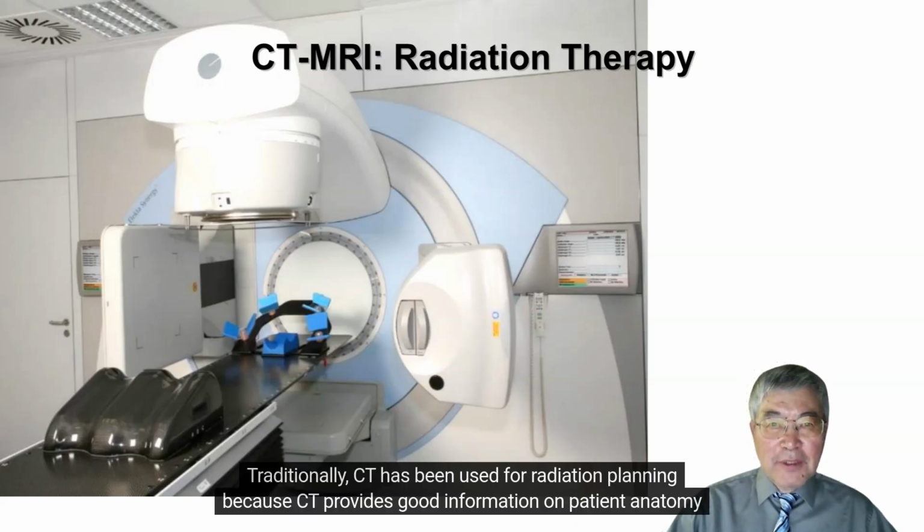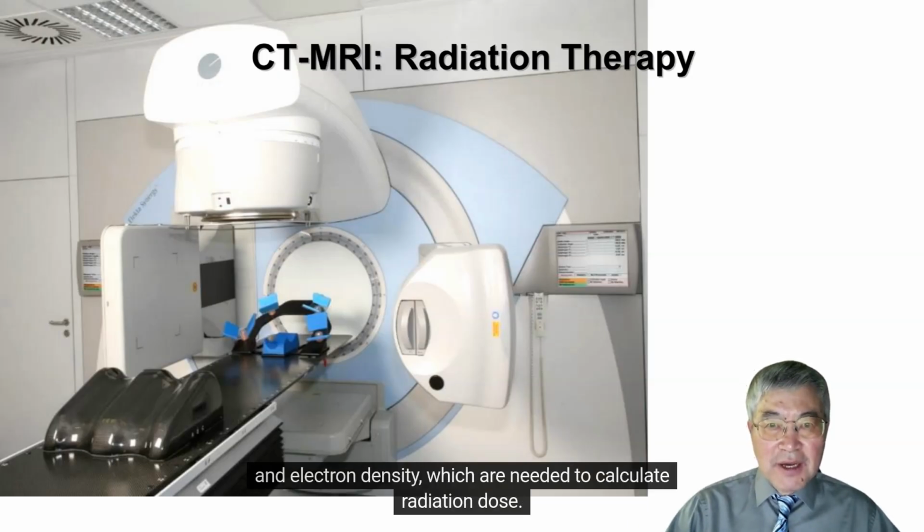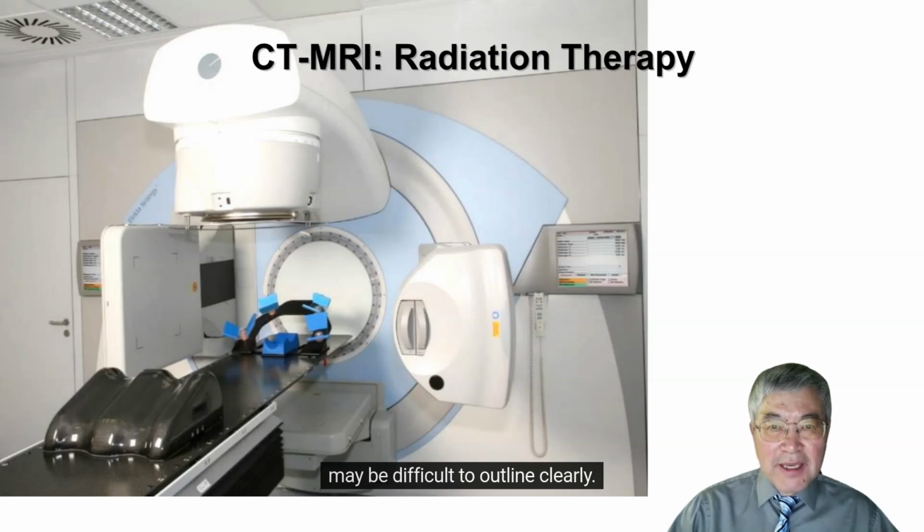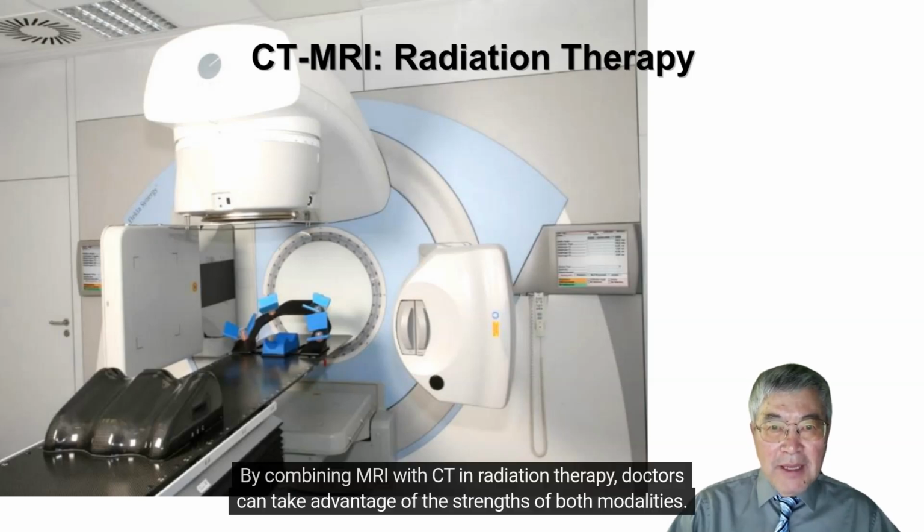Traditionally, CT has been used for radiation planning because CT provides good information on patient anatomy and electron density, which are needed to calculate radiation dose. However, CT has limited soft tissue contrast, which means tumors in organs like the brain, liver, or pelvis may be difficult to outline clearly.